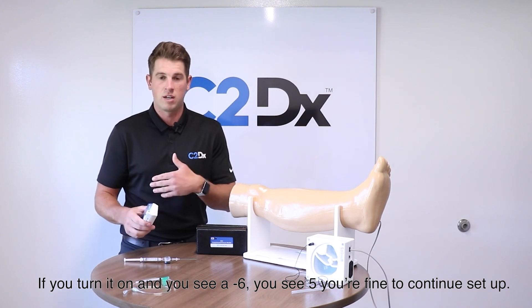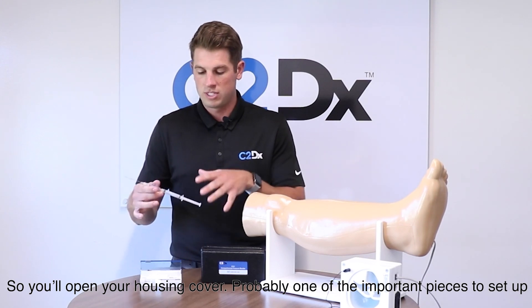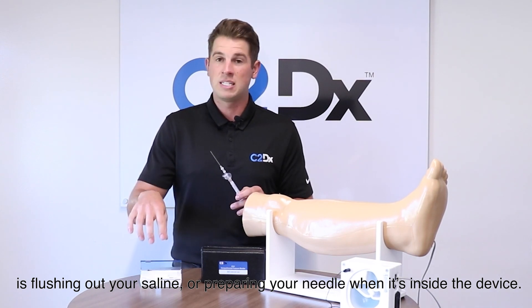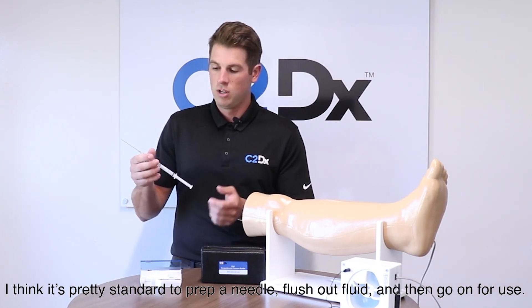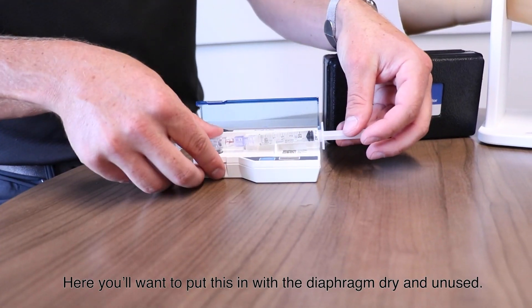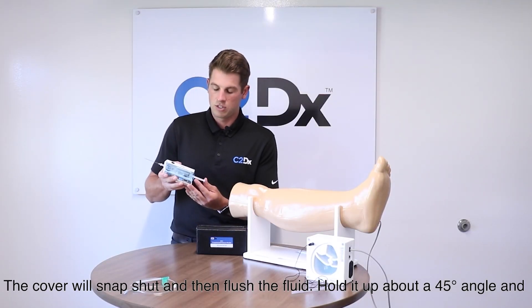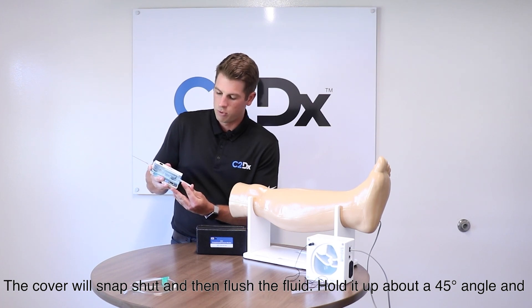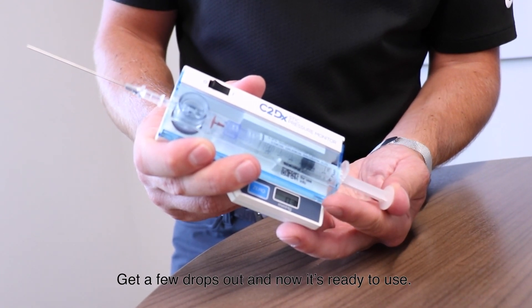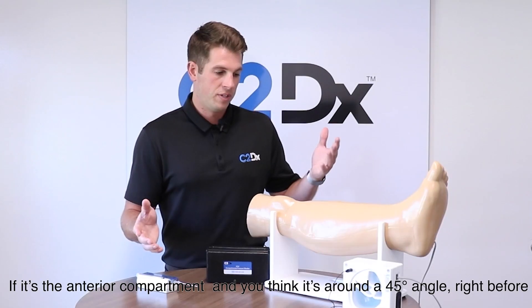If you turn it on and see negative six or five, you're completely fine to continue. Open up your housing cover. One of the more important steps is flushing out your saline and preparing your needle inside the device. You want to insert it with the diaphragm dry and unused, snap the cover shut, then hold it up at about a 45-degree angle and slowly flush the fluid through while watching the diaphragm fill up without any air bubbles. Get a few drops out and it's ready to use.